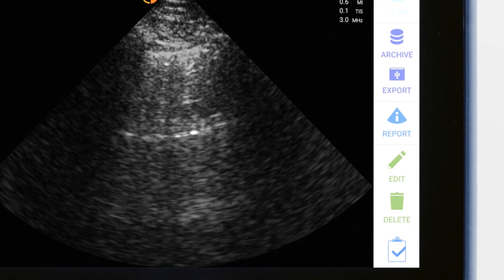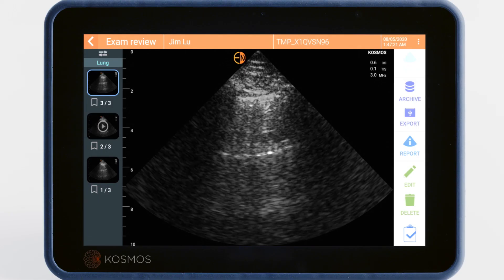There are other options available on the right-side menu. Video 8 discusses image editing, annotation, and measurement. Video 9 focuses on exporting images.